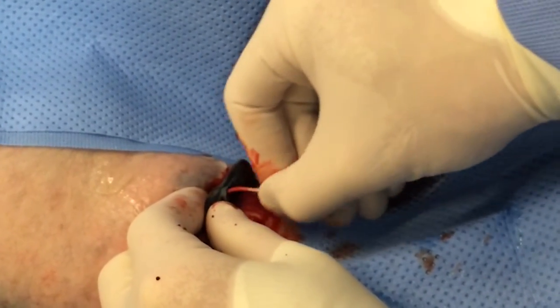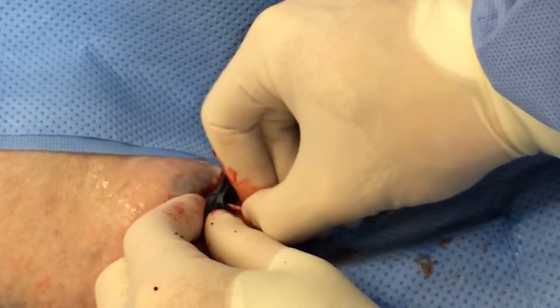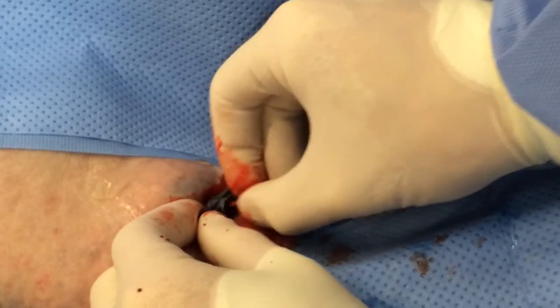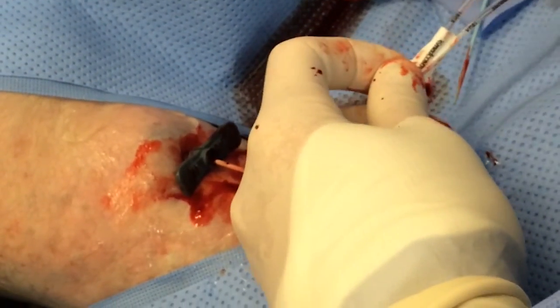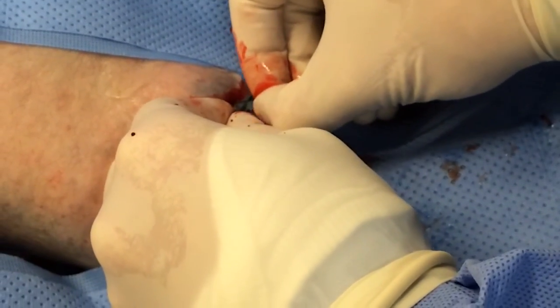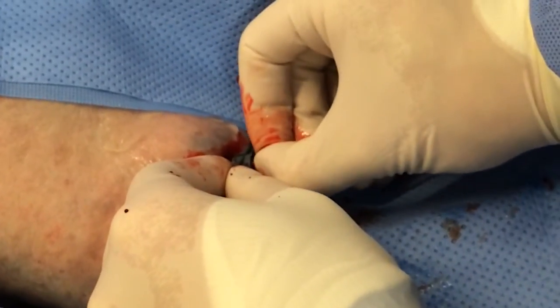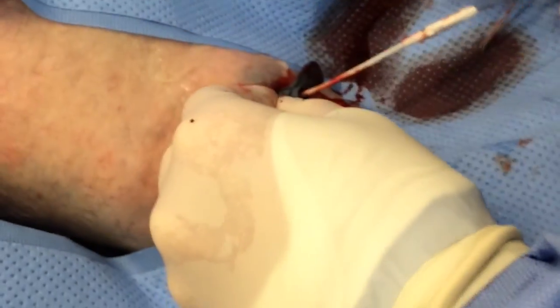And sometimes there's a little bit of friction here, but if you meet any real resistance, don't push. Come on out and try again. All right, here he goes. He's just clearing out his little wire guide there. All right, he's putting it in. You don't want to put it in all the way to the hub yet, because you're going to need to break off that dilator. You'll see what that means in just a sec.